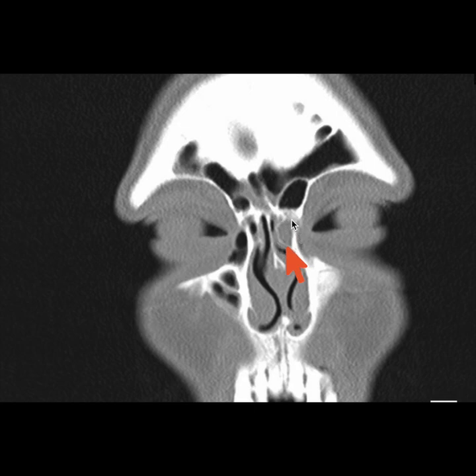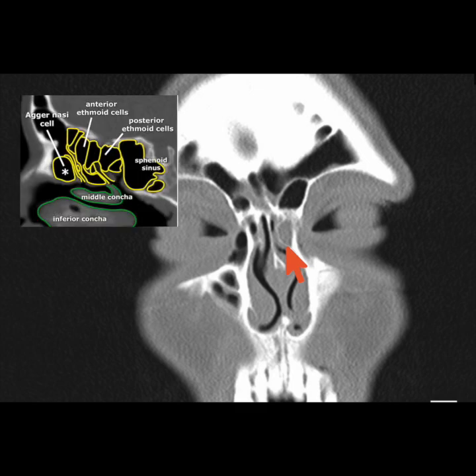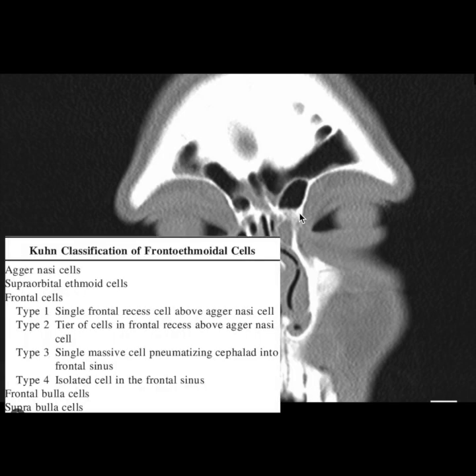This is an agger nasi cell. What is an agger nasi cell? It is the anterior-most ethmoidal cell — the ethmoidal cell that started walking, went all the way in front, and decided to sit there. This is the area of the frontal beak, and this marks the demarcation of type 3 and type 2 frontal cells.